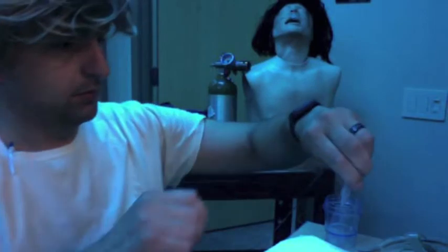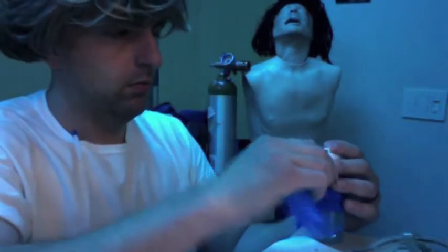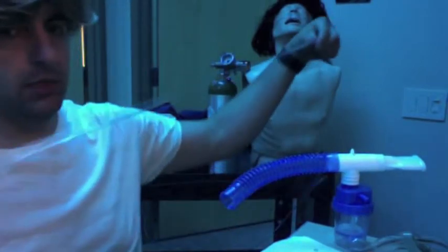We're going to assemble our kit. So we're going to take our cup. We're going to take our 2 medicines, which again look very similar. Put them both in. And put the lid on. We're going to find the T piece. We're going to find the mouthpiece. We're going to find our exhaust. And we have our oxygen tubing.